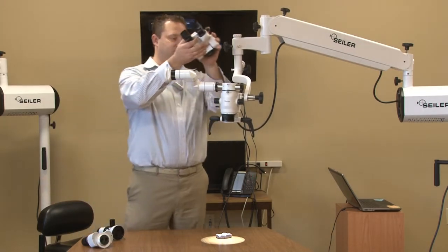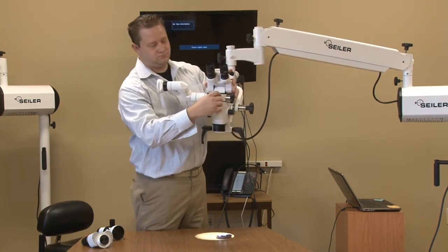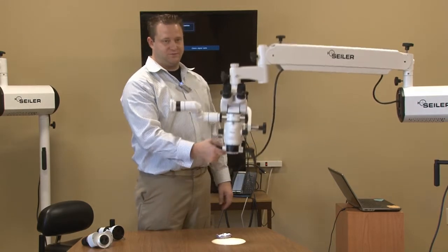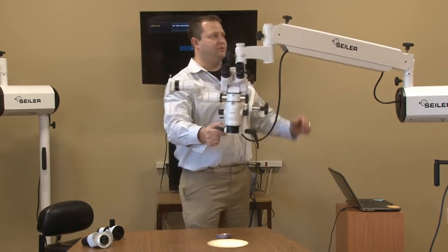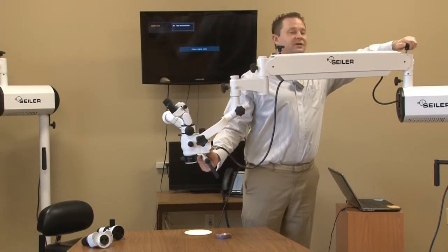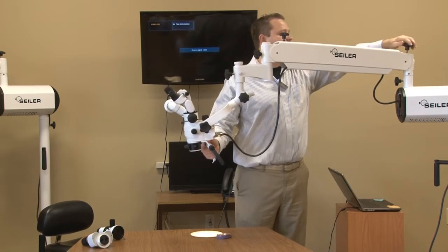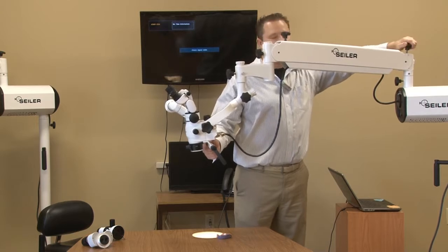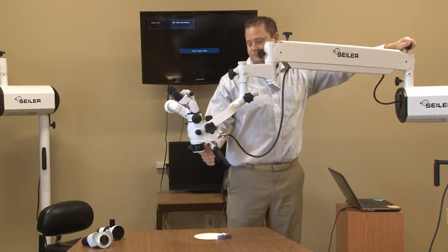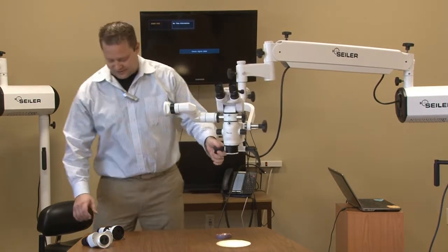We're going to go ahead and put the binocular head on. Remember, it's going to add a lot of weight to this, so you're going to see the microscope drift down. What we want to do — don't lock — we're going to come back to the panographic arm and make the piston arm stronger. This adds more weight than any other accessory to the microscope, so we want to make sure that we have that locked down pretty good.